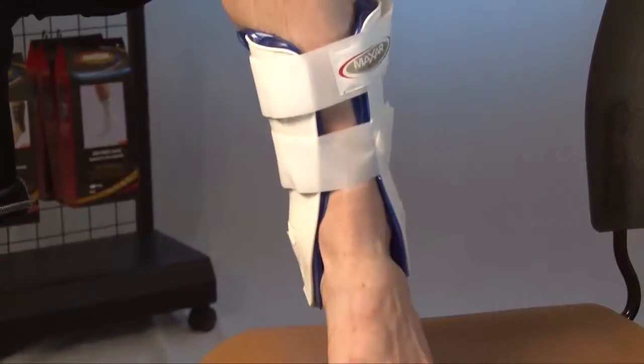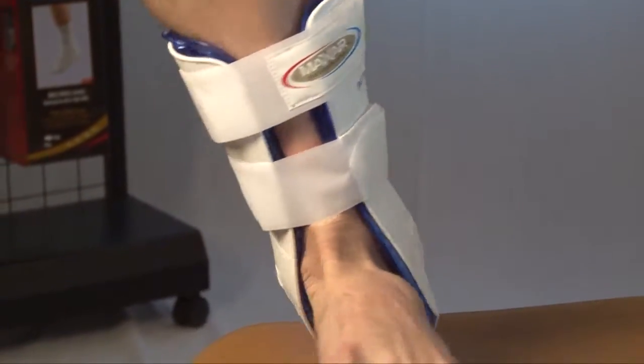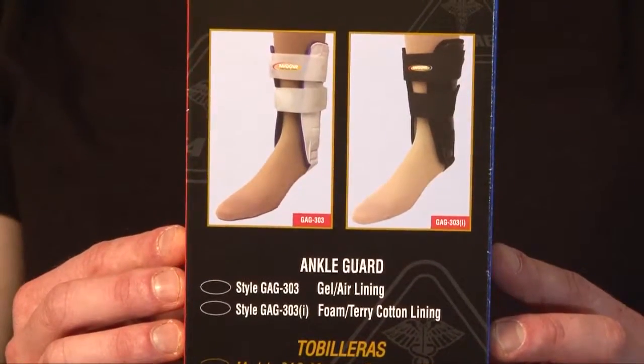It is highly recommended by doctors for the medial and lateral support to stabilize the ankle joint. It's great for rehabilitation and prevention during sports activities, and it provides great protection of weak ankles from re-injury.